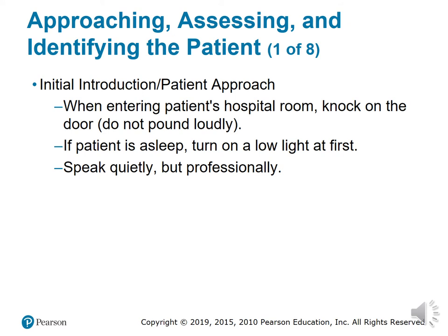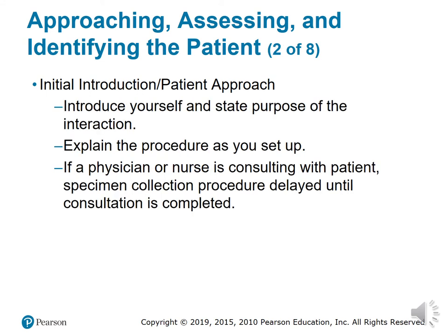Initial introduction and patient approach. When entering the patient's hospital room, knock on the door. Do not pound loudly. If the patient is asleep, turn on a low light at first. Speak quietly but professionally. Introduce yourself and state the purpose of the interaction. Explain the procedure as you set up. If a physician or nurse is consulting with the patient, specimen collection is delayed until the consultation is completed.